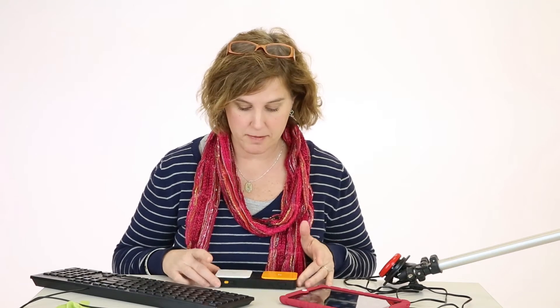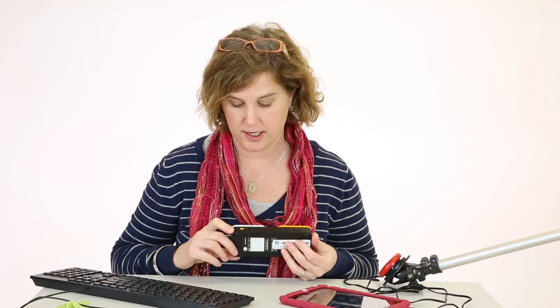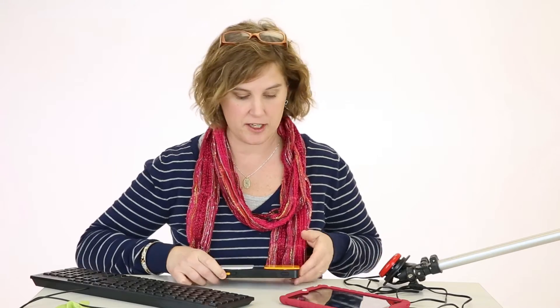We're going to go through some of the features. We want to make sure that the switch is turned to on. Under the white button, you have the on/off feature, so just make sure that's turned on.